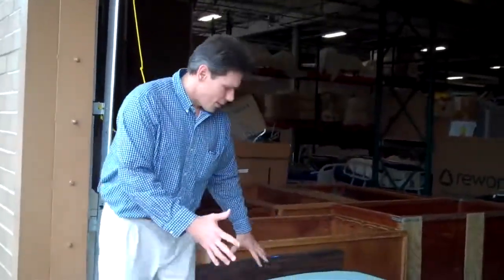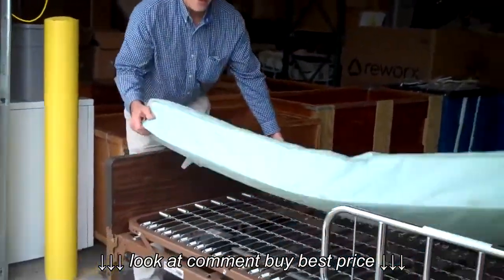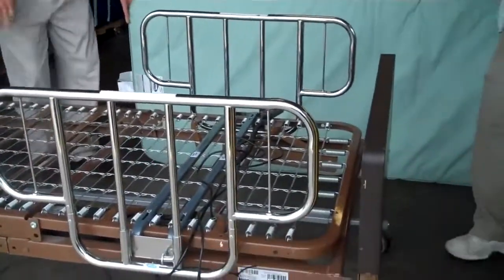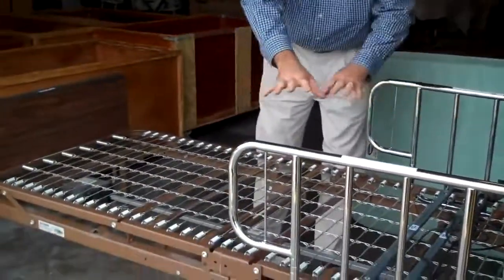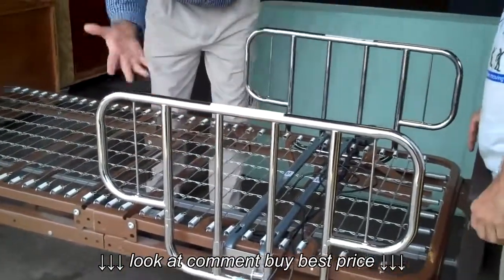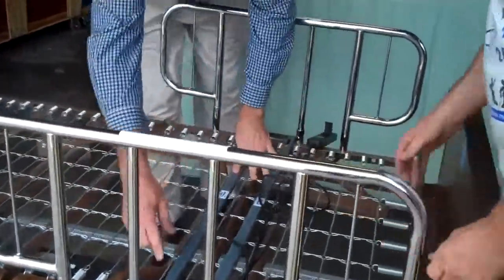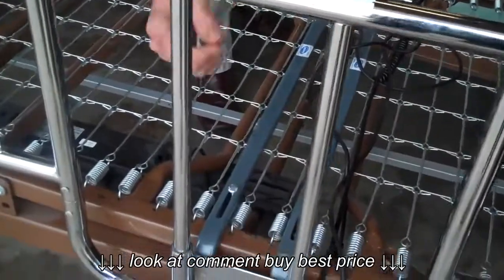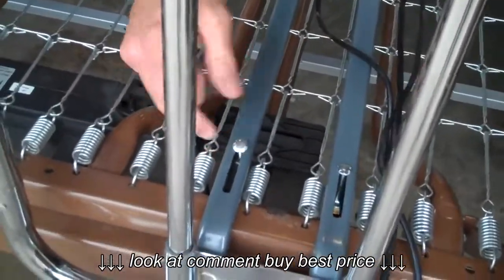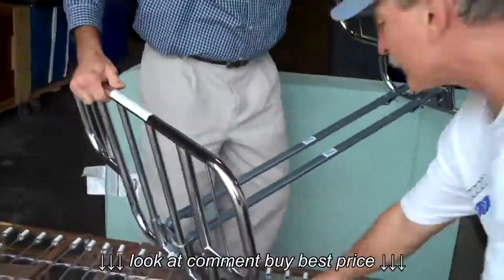So the home care bed looks just like this. We have a mattress here we're going to go ahead and take off. I have a helper with me. The side rails could be any numerous type of side rails, but some are spring loaded — you just push on them and they come right off. These actually have some wing nuts that you have to use a pair of pliers to undo underneath there to loosen them a little. And then the whole rail system comes off.